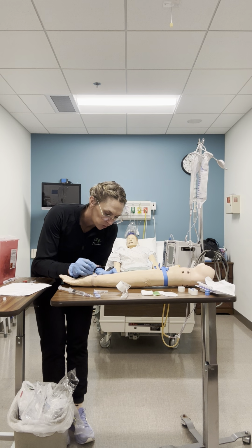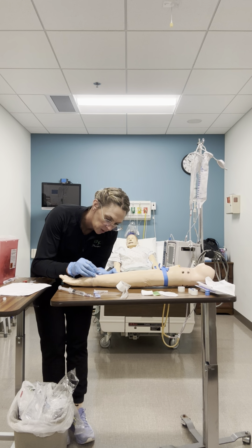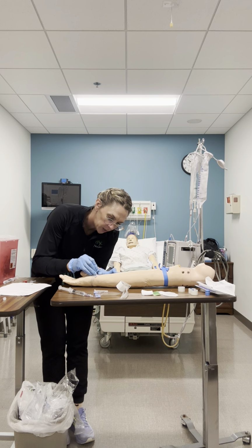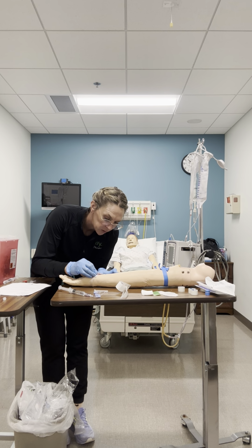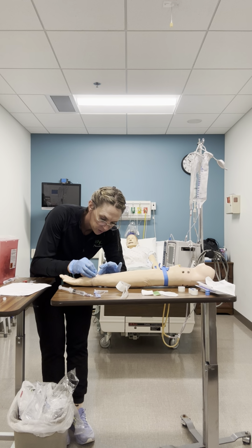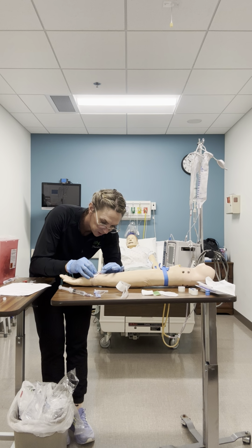Let the patient know that they're just gonna feel a slight poke. My bevel is up. I'm going in along the line of the vein and at a 15-degree angle. Go in. Okay, I've got a flash. So at this point, I'm gonna go half an inch more or a quarter of an inch more. Yep, we actually have saline coming in, so that is a flash.